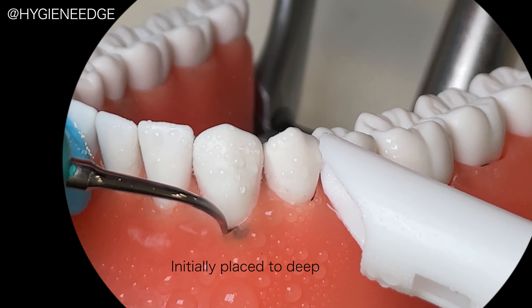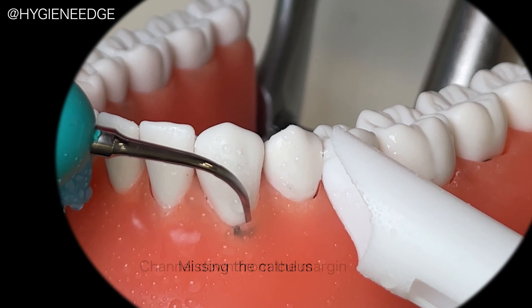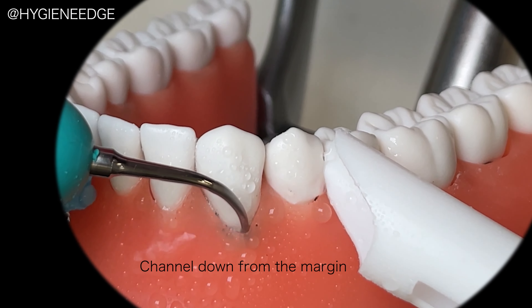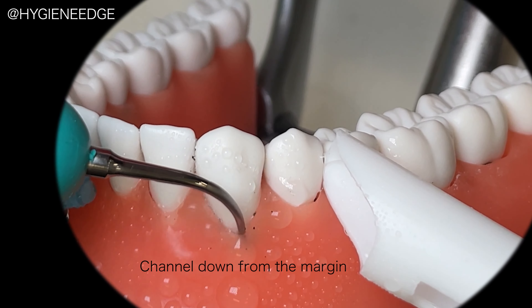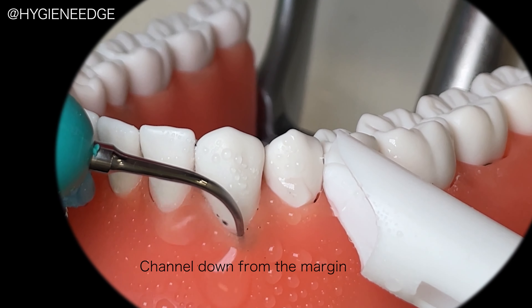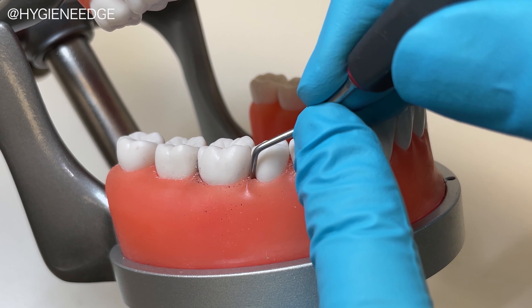If a deposit gets missed, it might be that they're initially placing the power scaler to the full depth of the five millimeter pocket instead of starting at the margin and channeling down with horizontal and oblique strokes to the base of the pocket and then back up. This typodont's teeth also mimic the hardness of natural teeth, so you can confidently practice with power scalers or troubleshoot weaknesses when it comes to calculus removal. And if you have a tenacious deposit, you can practice applying more lateral pressure or use an assisted fulcrum to aid in the removal.